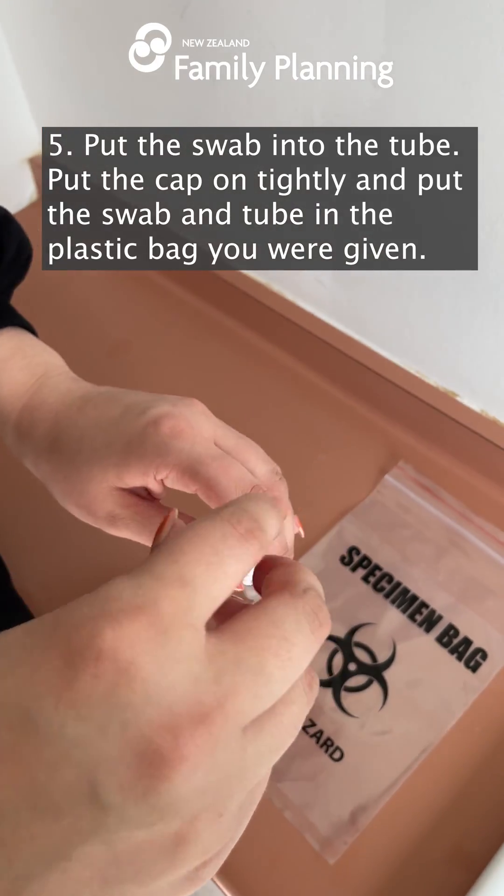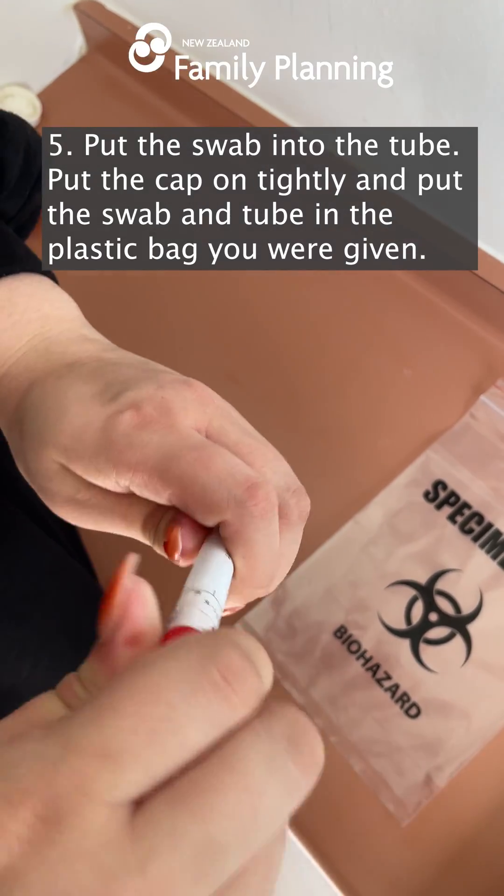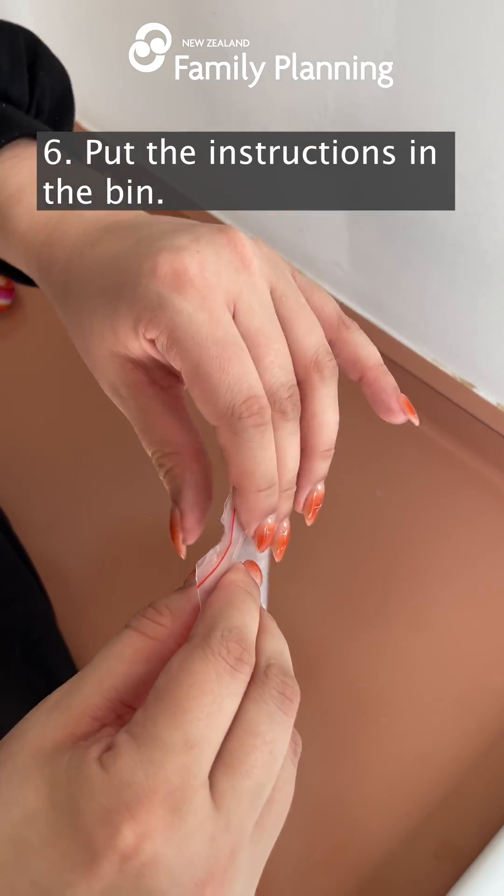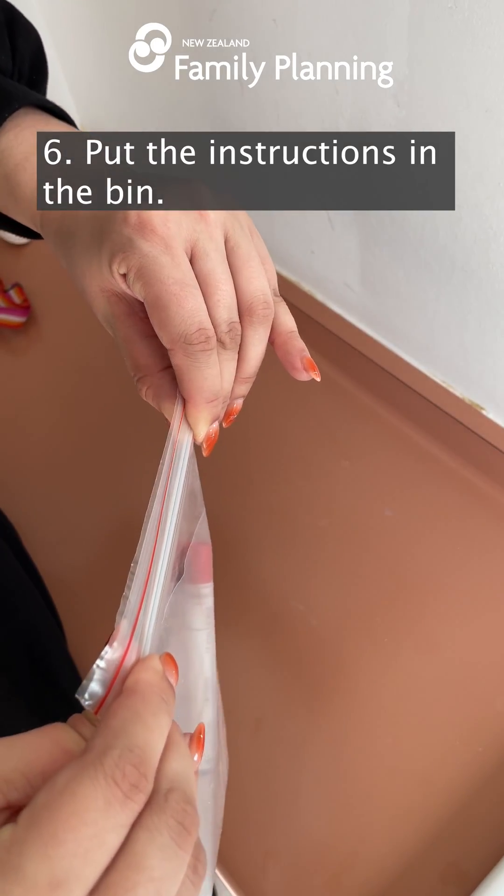Put the swab into the tube. Put the cap on tightly and put the swab and tube in the plastic bag you were given. Put the instructions in the bin.